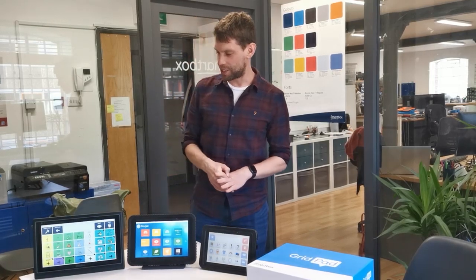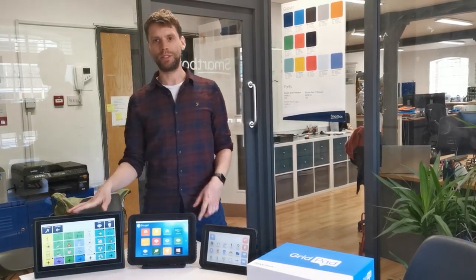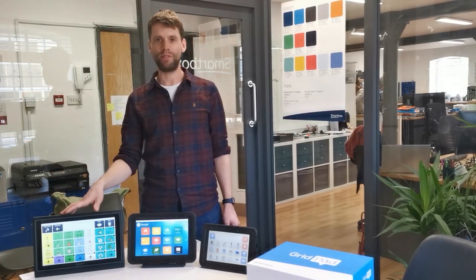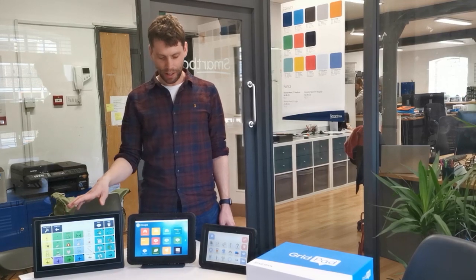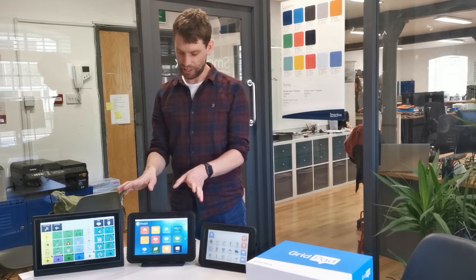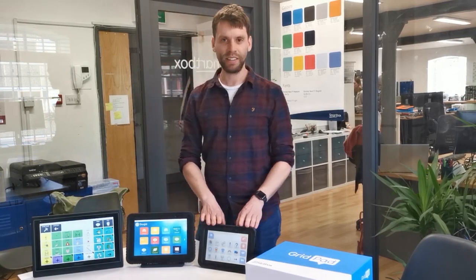Hi everyone, I'm just making this quick video to give you a little guided tour of our latest range of GridPad communication aids. So hopefully you're familiar with the GridPad 12 which we launched last summer, which is our 12.5 inch dedicated AAC device. This month we're adding to the range, so we've got brand new GridPad 10 and GridPad 8 devices.